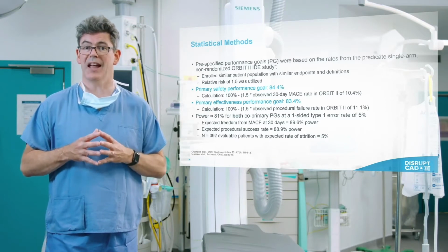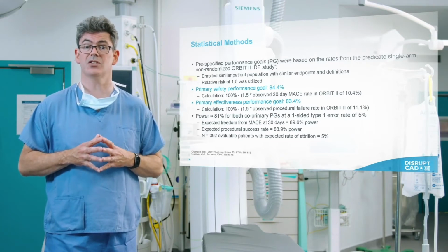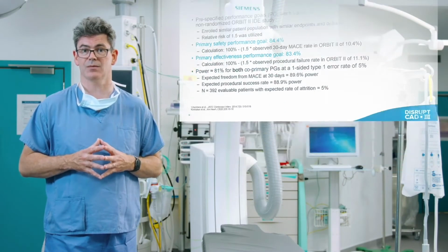This study is over 80% powered for both co-primary performance goals at a one-sided type 1 error rate of 5%.